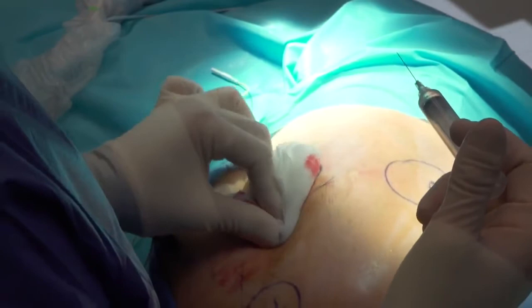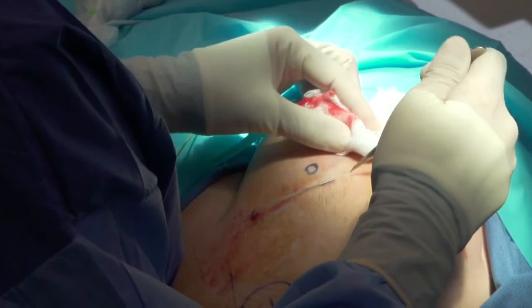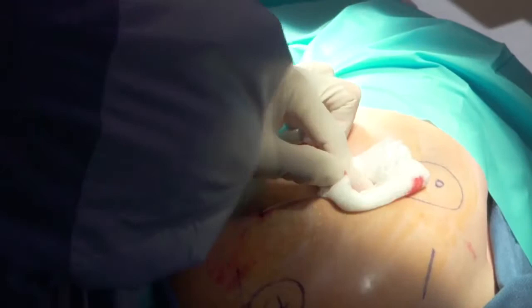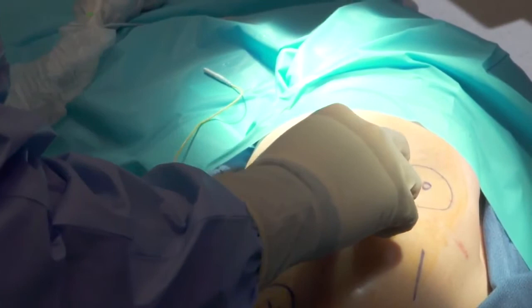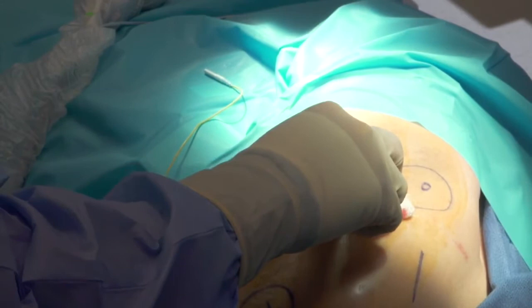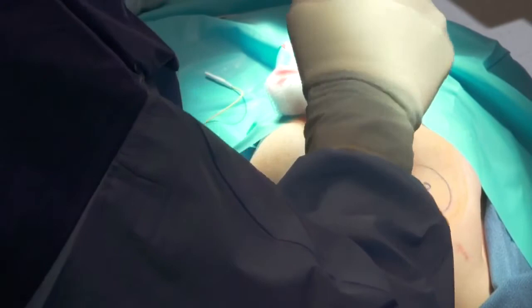All right, my man, can I have the 11 blade? Good job, my man. I just need the stylet. The stylet is the one with the hub on it. There's one with a hub, and then there's the one that goes just like this, like the other stimulators we do. You're going to grab that second. But the first thing is the one with the pointy edge. Stylet and two-way. All right, good job.